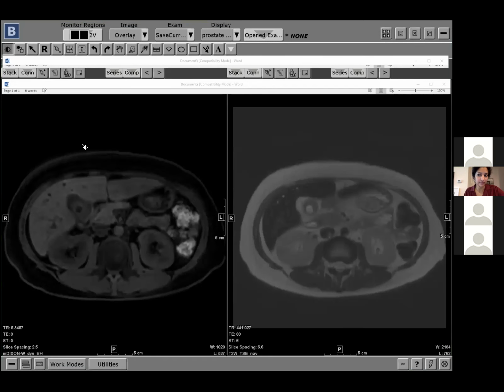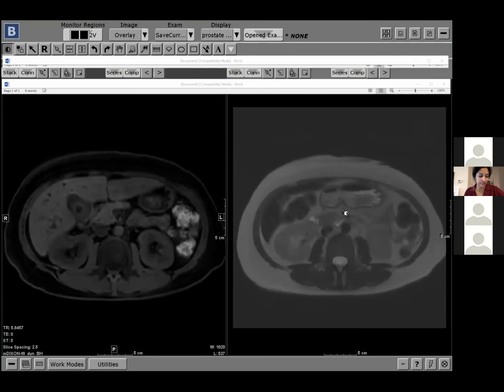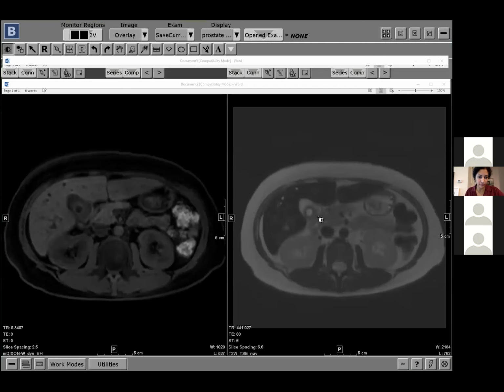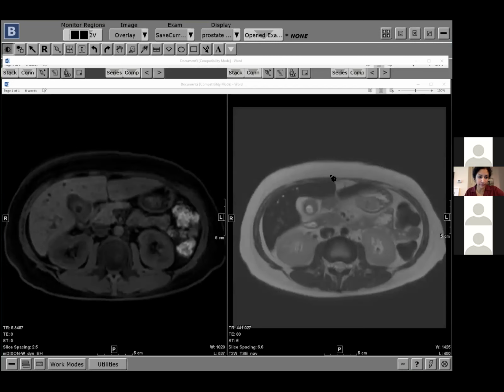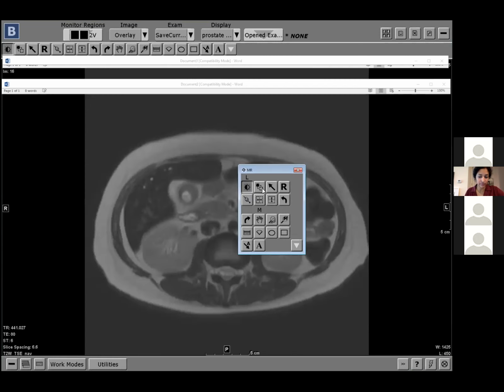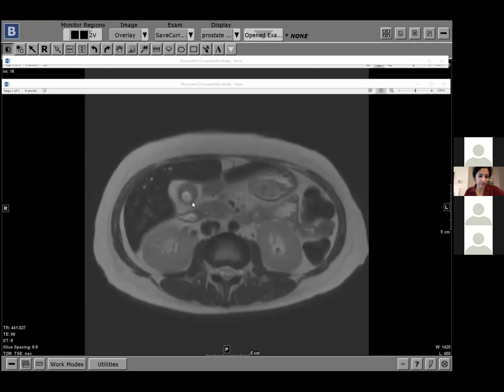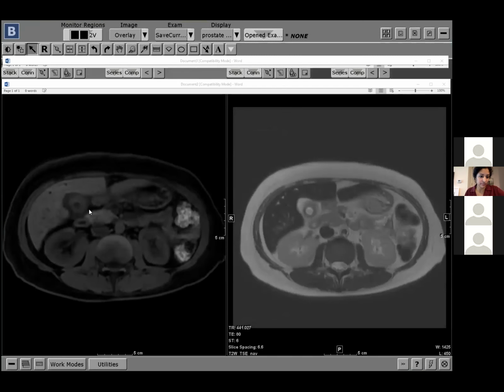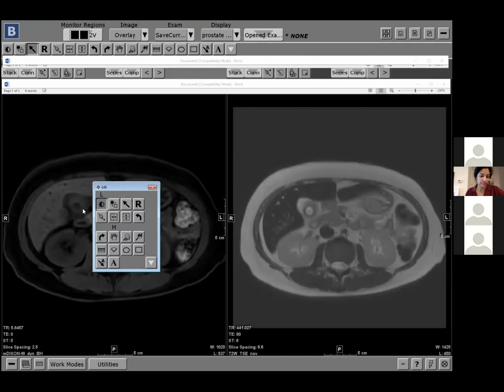This is, I forget the story of the patient, but it was an MR, and I'll just go straight to the finding. You can see that in this patient, the gallbladder has a very peculiar appearance on T2. You can see very asymmetric thickening of the gallbladder wall. There's also what looks like edema of the gallbladder. Here it is on the pre-contrast T1.